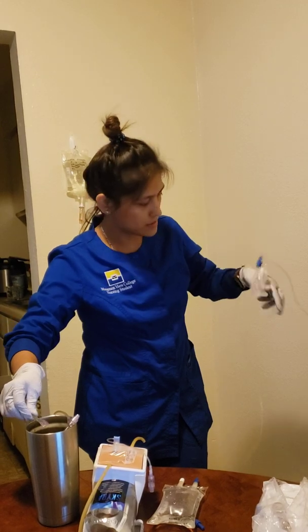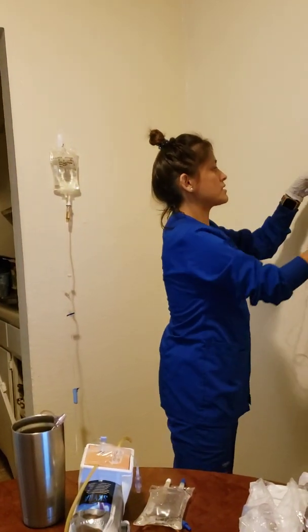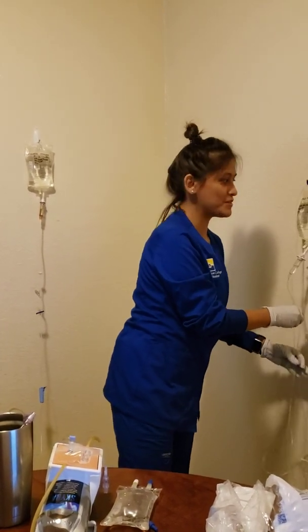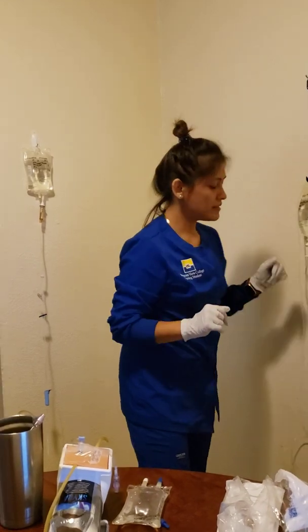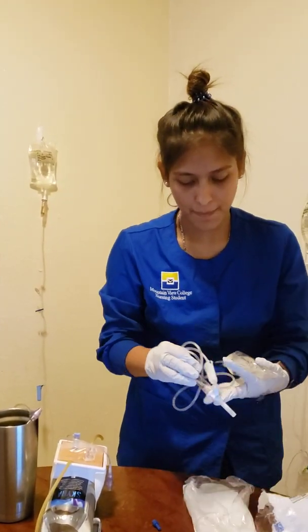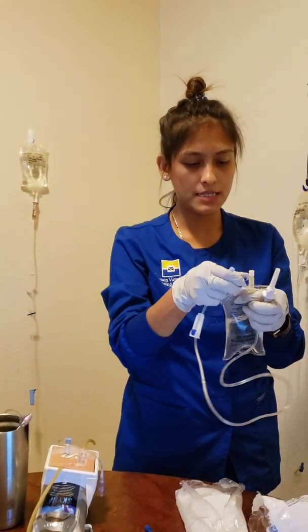And so that looks good. So I'm going to clamp and make sure that everything's good. Also when I checked Miss Chi's IV, I unclamped it and then clamped it back up. So that's good. And now I'm going to prime my ampicillin. Again, making sure that everything stays sterile.